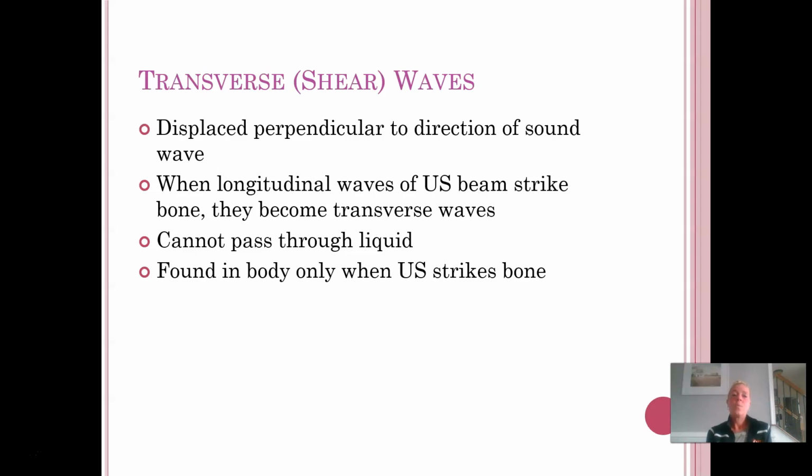And so what happens is those longitudinal waves come down. If they strike bone, then they just start to shear off, and they start to build up in the area. Shear waves or transverse waves cannot travel through liquid very well, and so they build up in the area, and this can cause areas of increased heat buildup, which will eventually become uncomfortable for your patient.